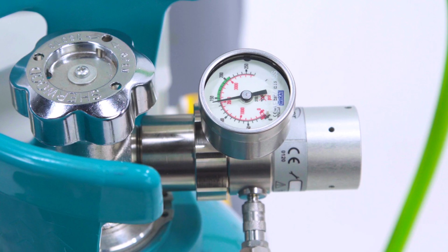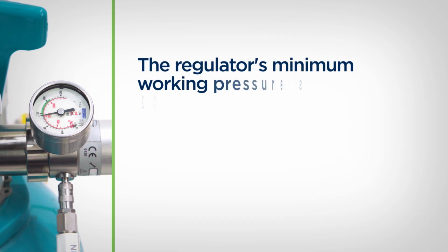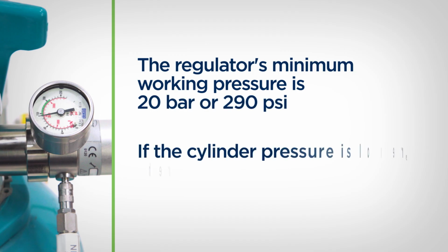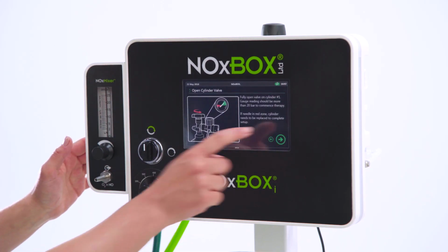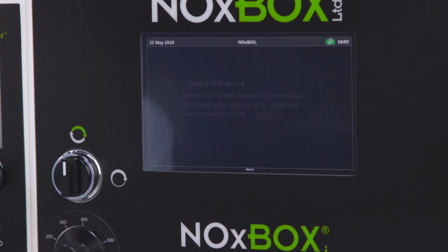Check the regulator gauge connected to cylinder 1 and confirm that the pressure gauge indicates more than 20 bar or 290 psi of pressure as marked in the red area. The regulator's minimum working pressure is 20 bar or 290 psi. If the cylinder pressure is lower, there may not be adequate pressure to start therapy. An automatic pressure test will now confirm you've connected the cylinder to port 1 and adequate pressure is detected.